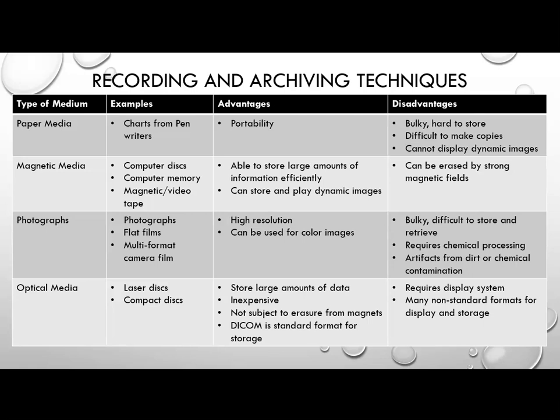For years we utilized film and photographs to store our information. The advantage to this is we were able to get very high resolution images. We can do it in color, but it's bulky and it does require chemical processing. So that's a technique that no longer do we have to teach you. And you can also impart artifacts from dirt or chemical contamination because of the processing.